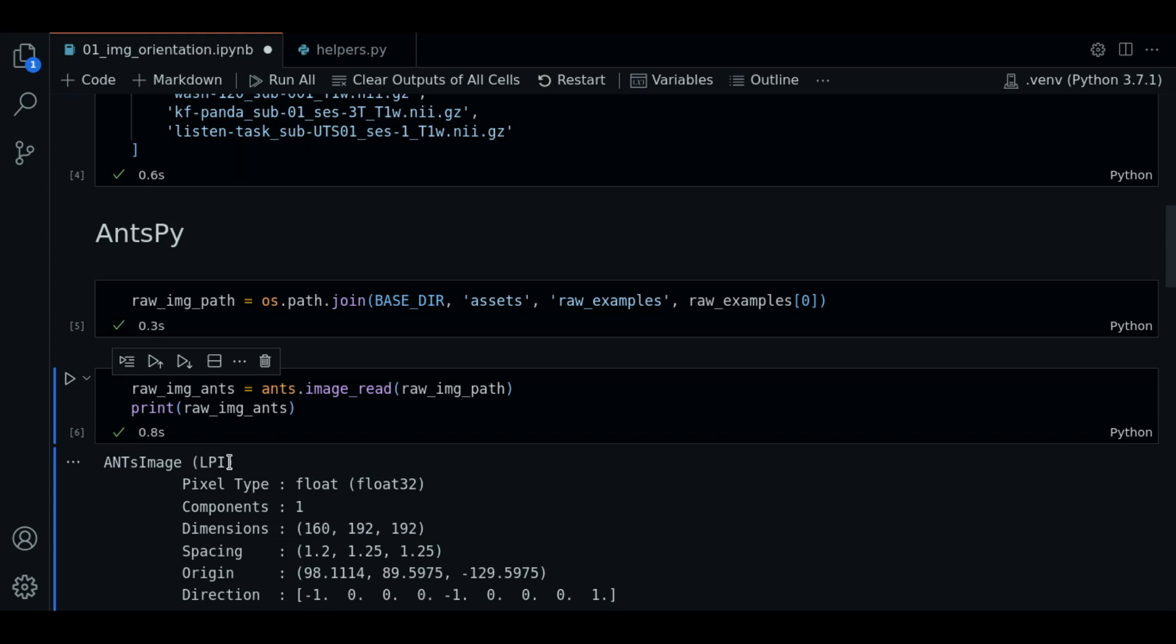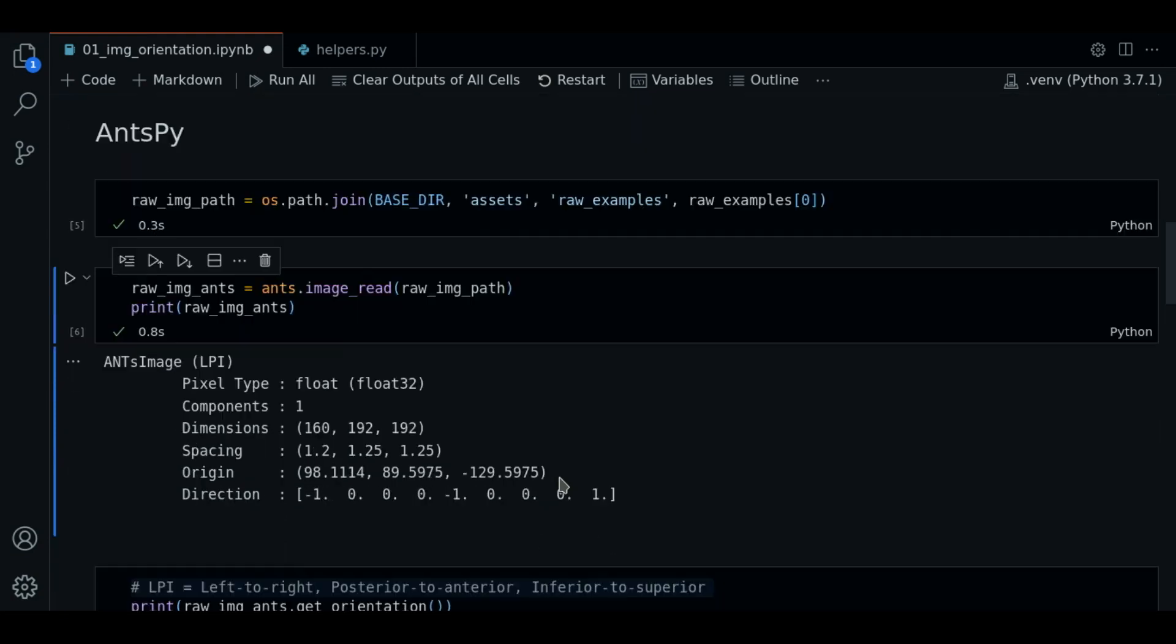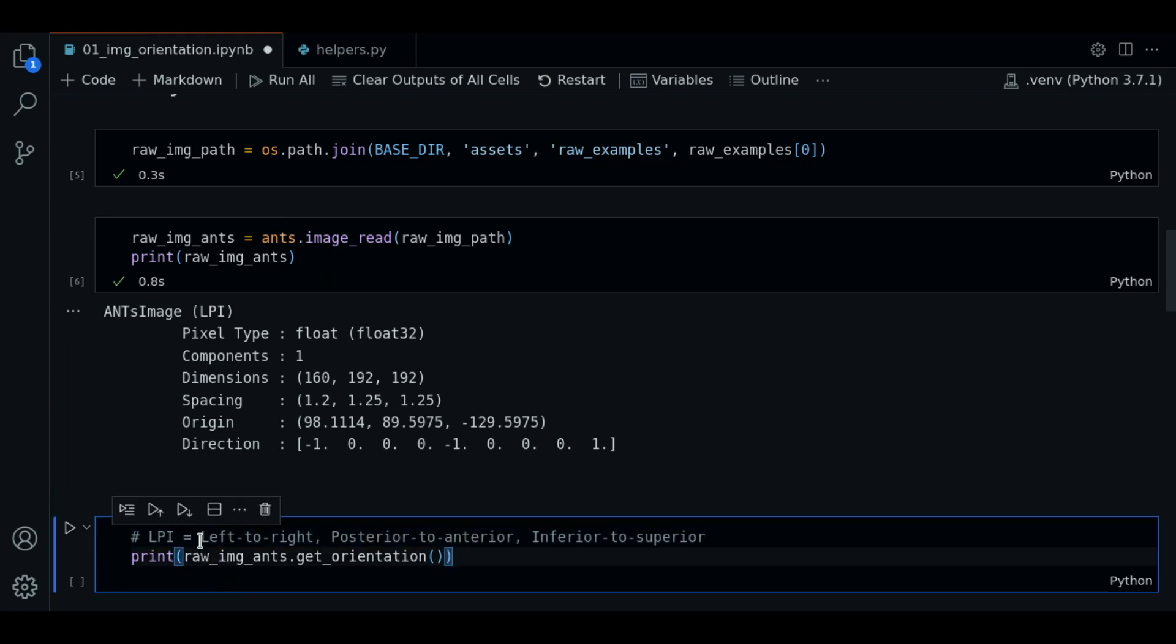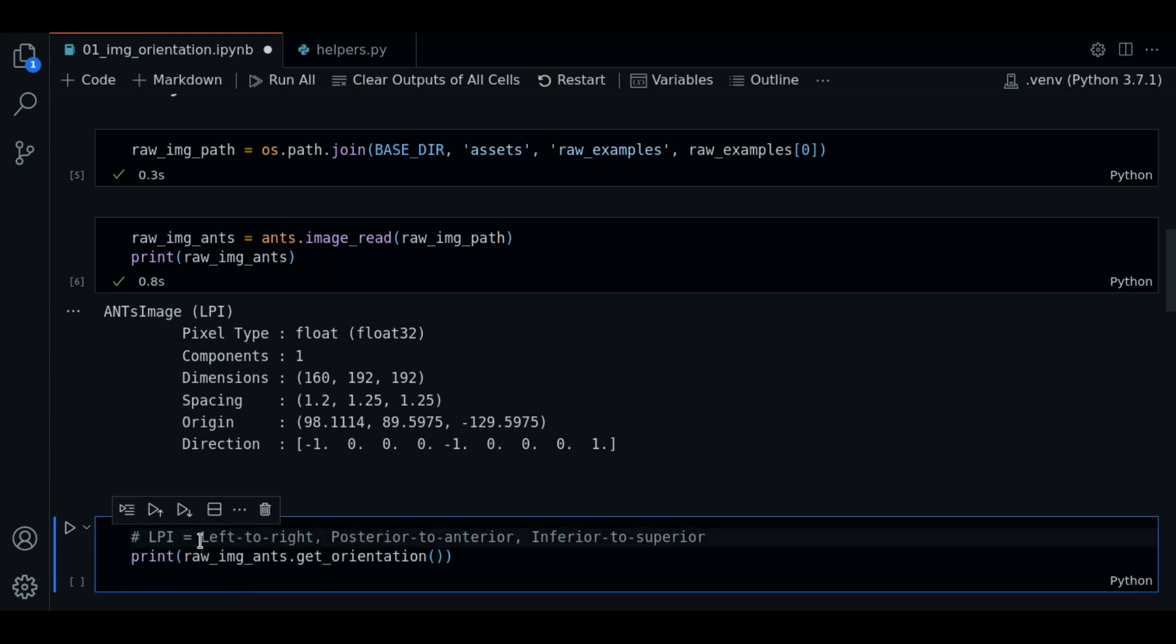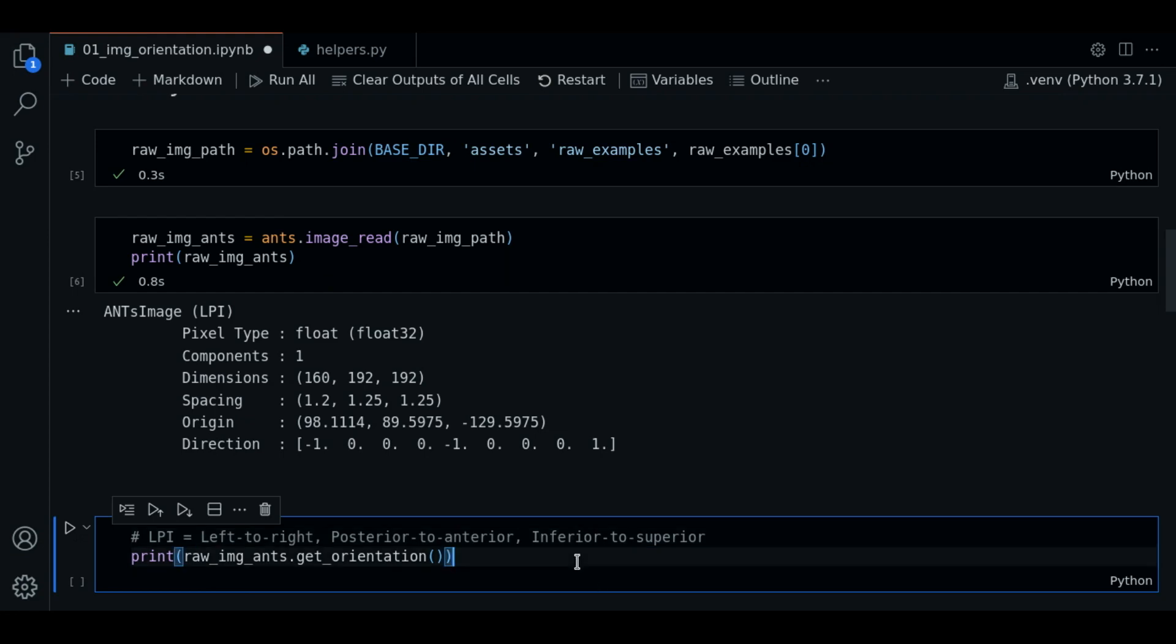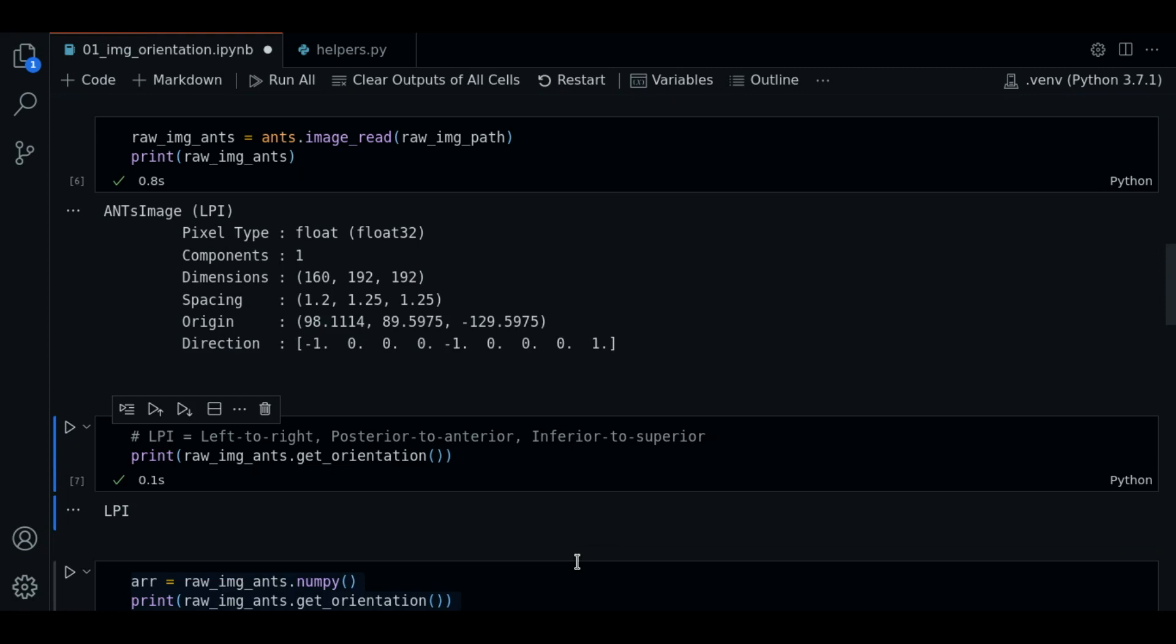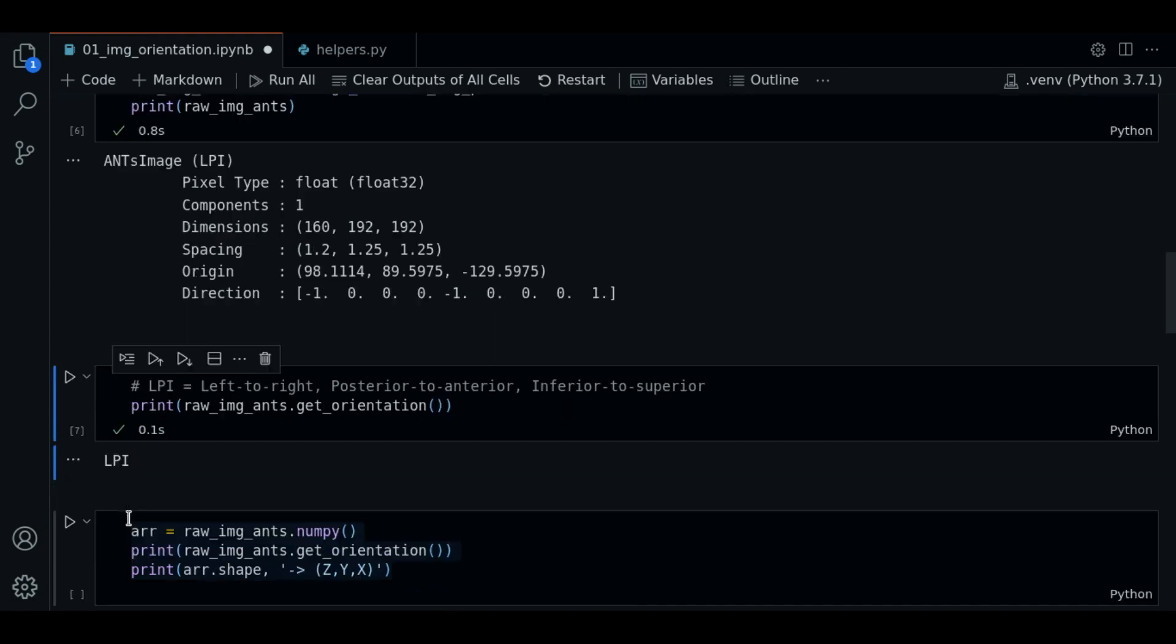In this case it is LPI. Let's see what this means. So LPI means the orientation of the image is L for left to right in the first axis, P for posterior to anterior in the second axis. We can use the getOrientation method to obtain the direction directly as well.